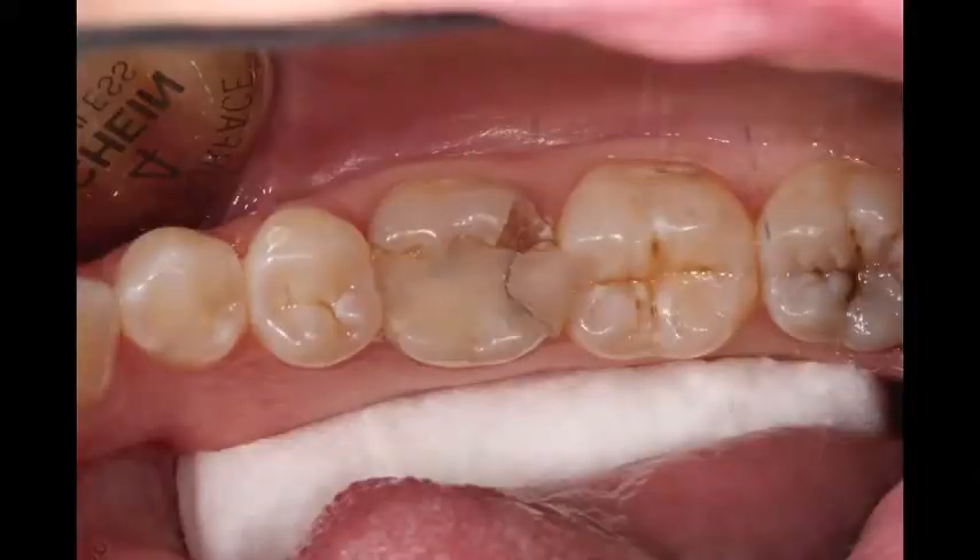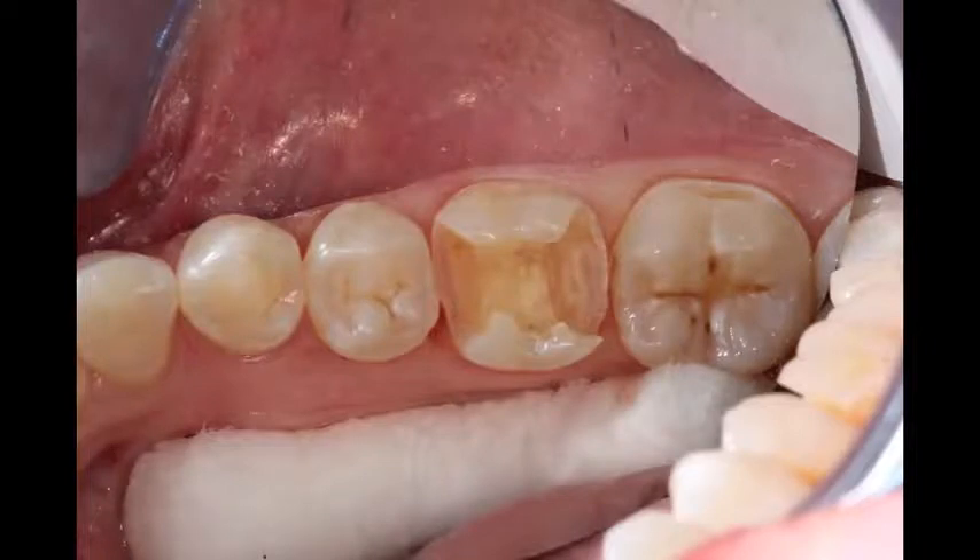Here's a clinical case. A patient comes in with a lower first molar — you can see it's a large composite filling with recurrent decay and part of that filling has broken away. We've removed the old composite restoration and removed the decay, and that's what it looks like. In our office at this point, we will always stop and take a photograph. It's just good record keeping and will help in your insurance narrative when trying to collect on the patient's insurance benefits.